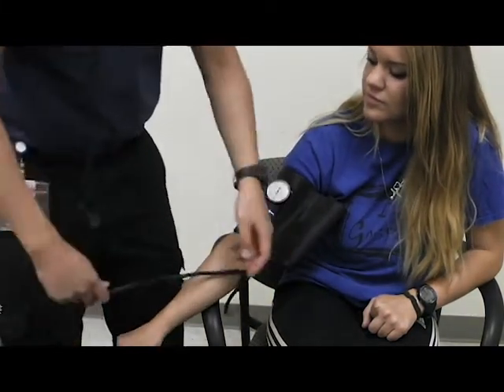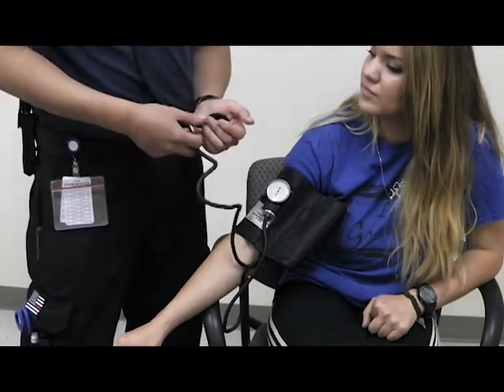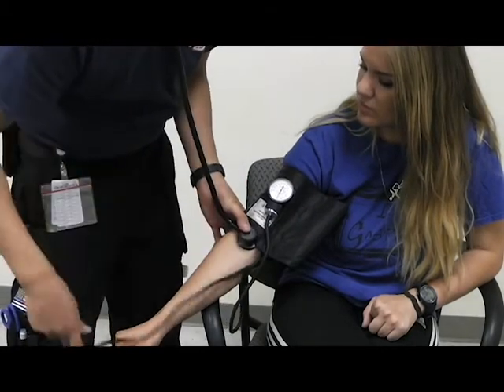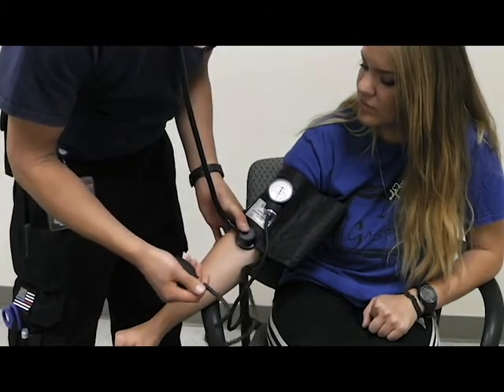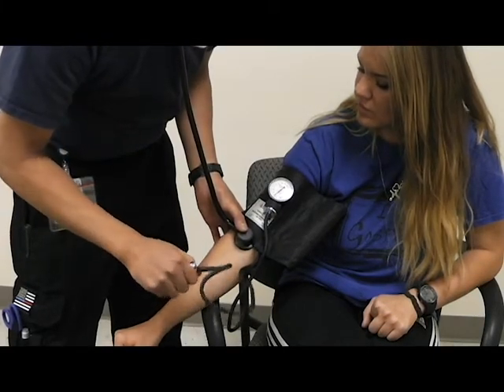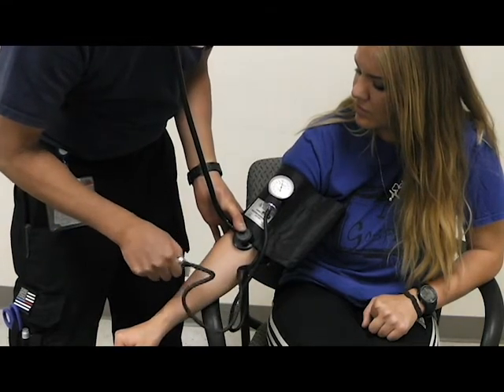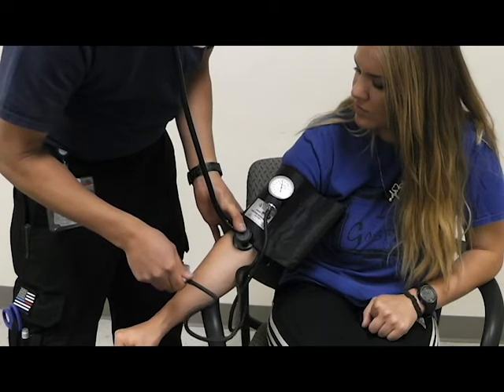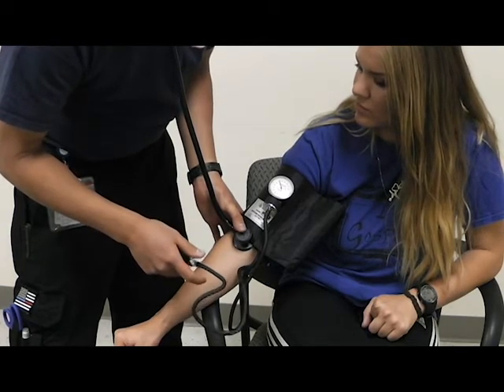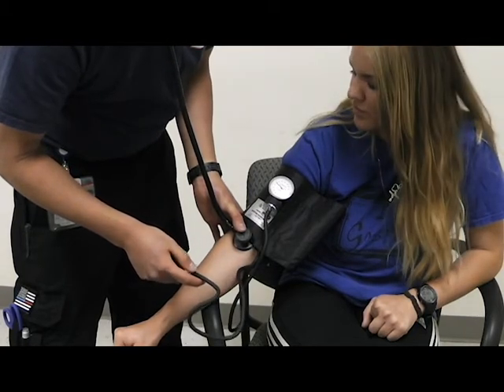Put your stethoscope in your ears and check to make sure it's still working. Place your stethoscope right underneath the cuff, hold it in place, and pump your blood pressure cuff up to around 180 to 200 depending on your patient. When taking this, release slowly and listen. You're going to listen for the first heartbeat you hear, and then the last time you hear it.